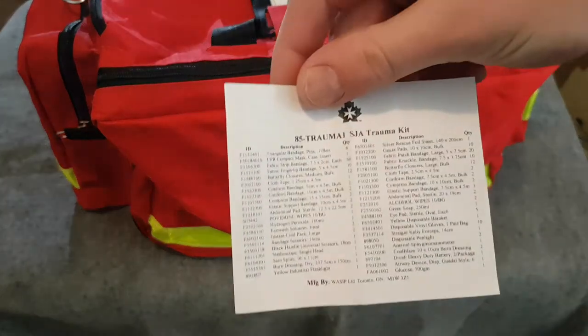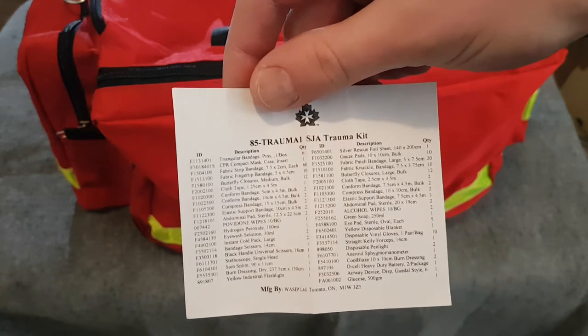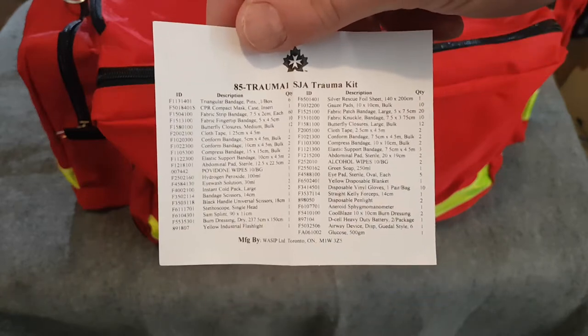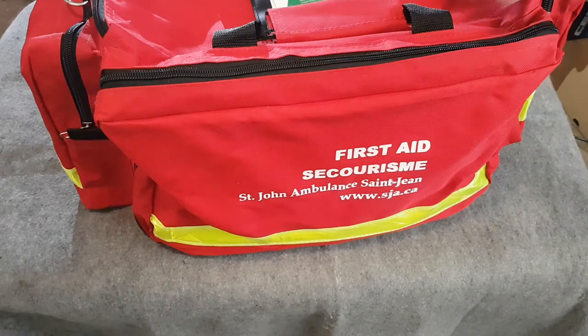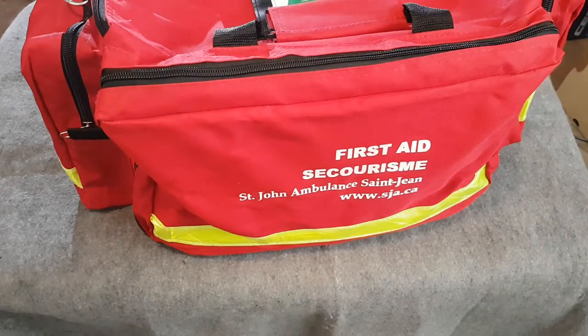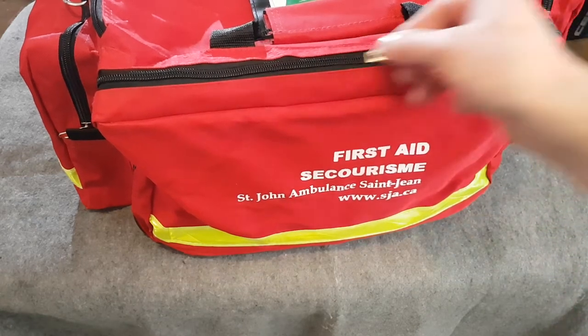According to the packaging contents list, this is the 85 Trauma 1 SJA trauma kit and this is what's all included with it. We're going to go ahead and open it up. I've rearranged it a little bit from how it actually came, so I'll just go through all the different compartments. It may not look the greatest but we'll show you what's in here for now.